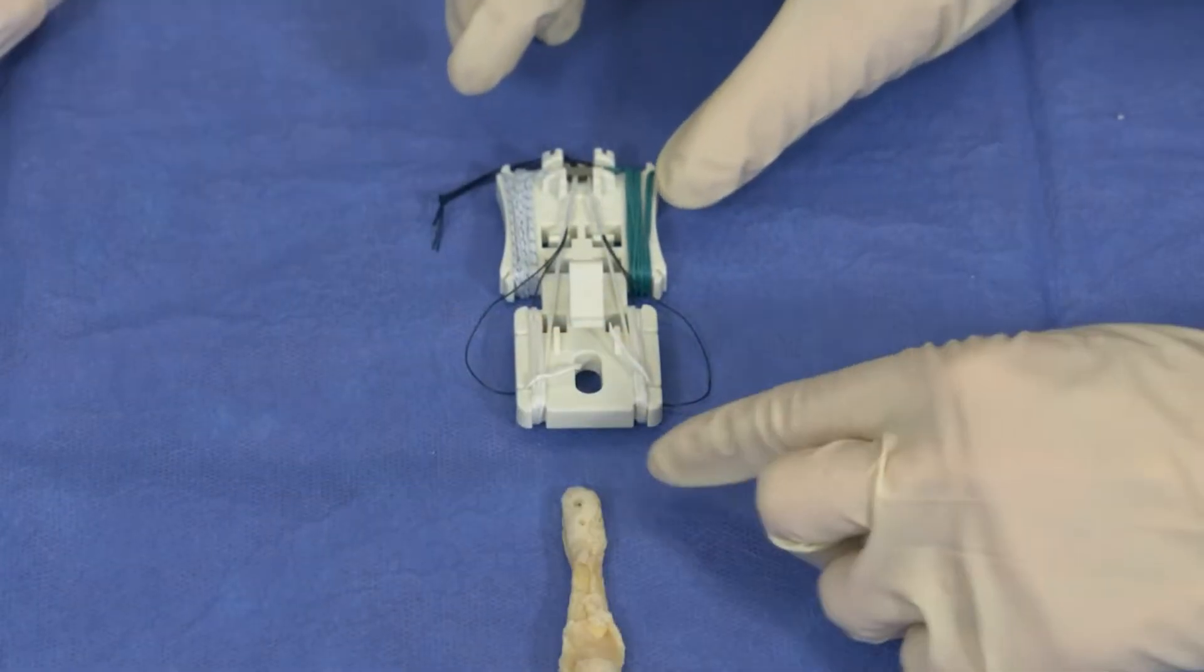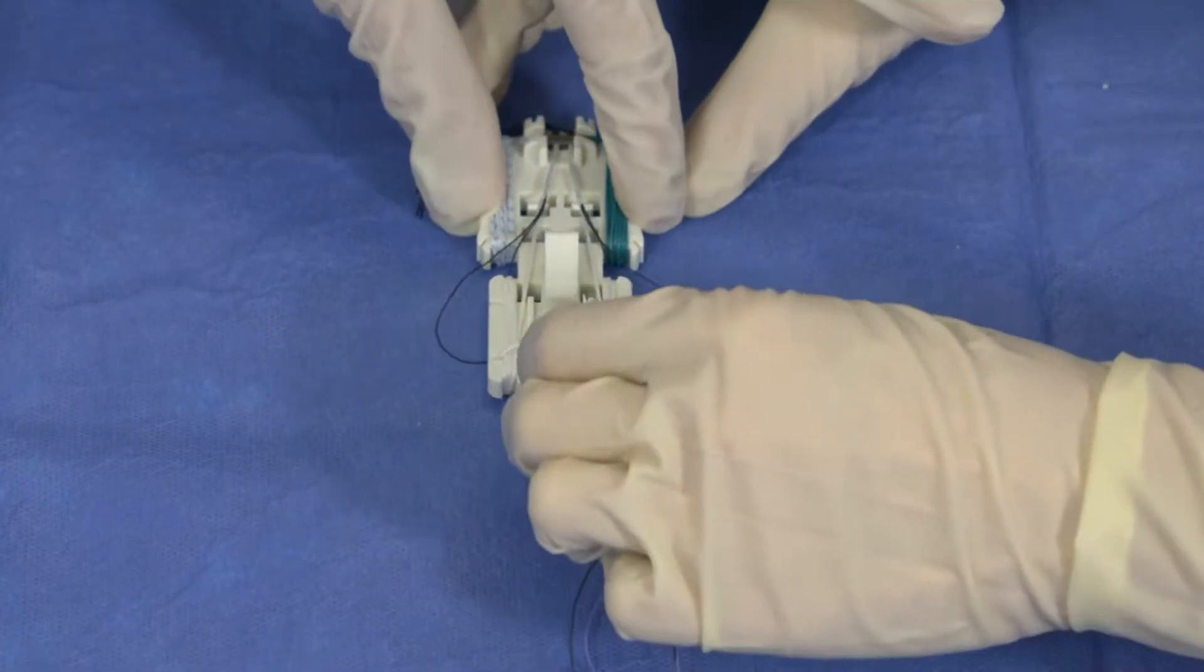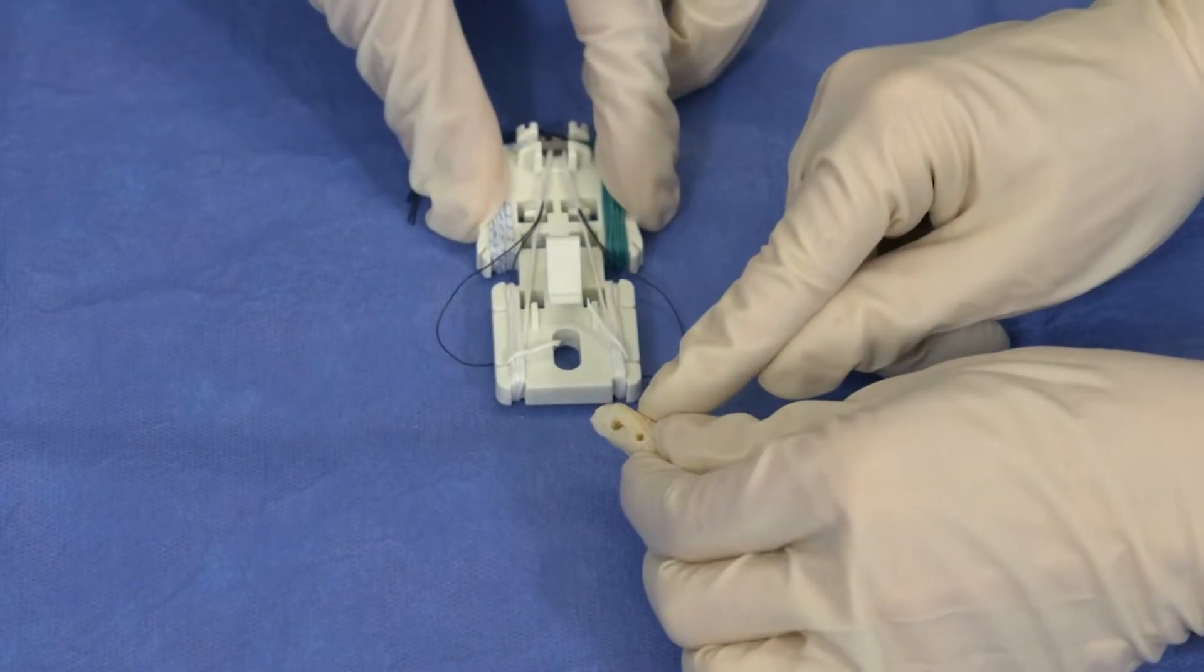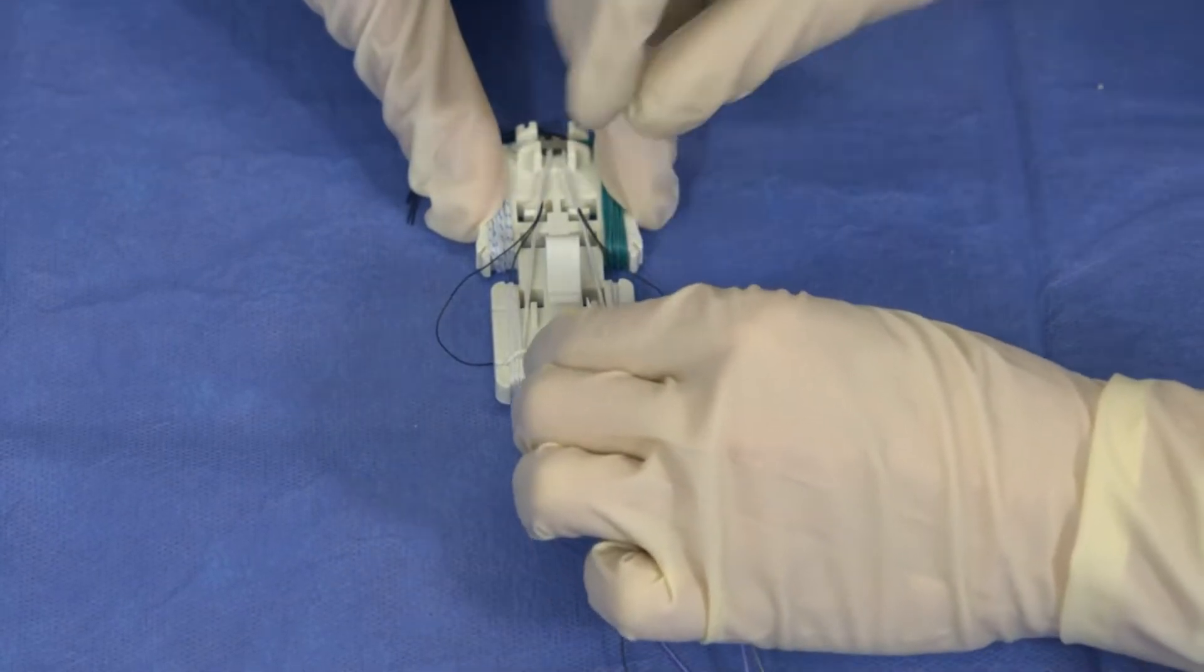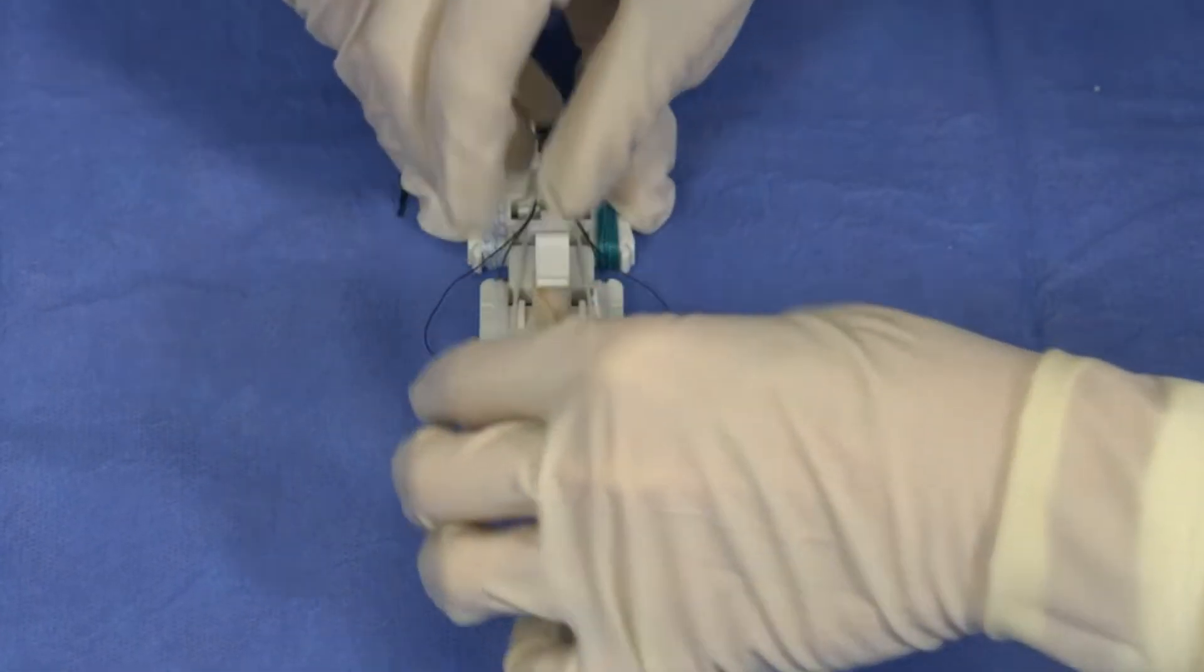The BTB graft will now be placed into the rigid loop BTB. When we place the graft into the clamp, the graft will change from this position and then it will be placed on its side and placed in the clamp.